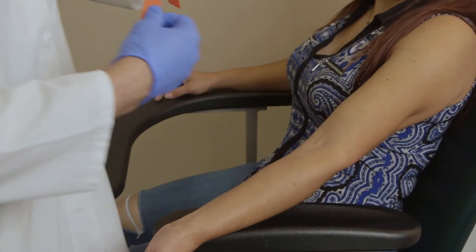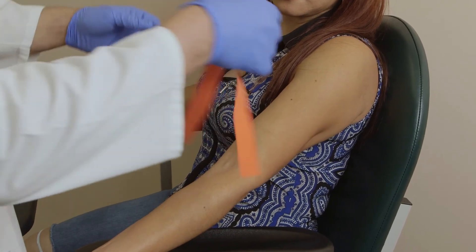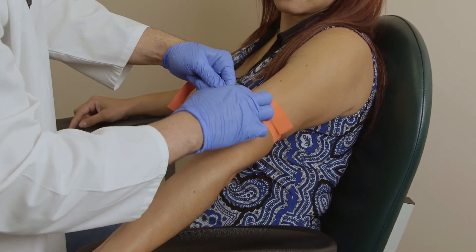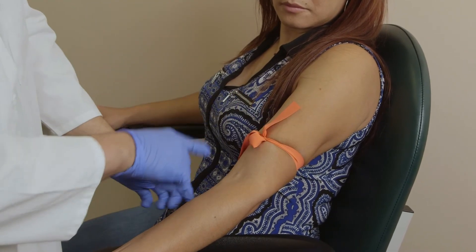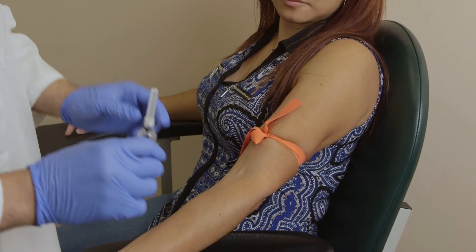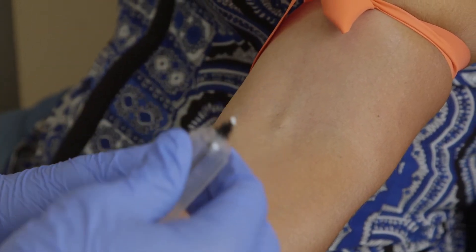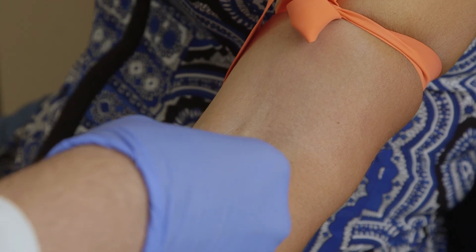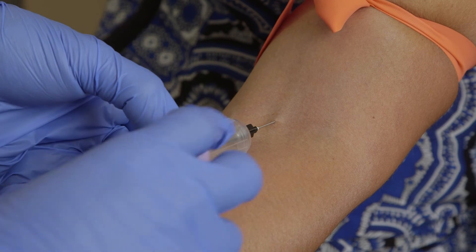I am going to put the tourniquet on the patient again, three to four fingers above. Remember — dog ears, never frog legs — positioned where it doesn't interrupt the area. We will proceed with the phlebotomy. I will use my dominant hand, anchor the vein, and proceed with the venipuncture. Make sure the bevel is up. I will grab and push.